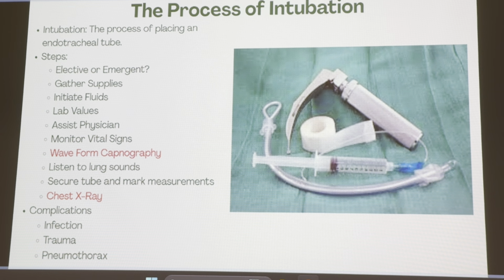So we're kind of pre-oxygenating them, we're bagging them, getting them ready to be intubated. And then that physician will say, all right, let's try it. And he'll try to place that endotracheal tube as well. So you may be just kind of assisting that physician. And like I said, you might also potentially be giving those sedation type drugs as well.